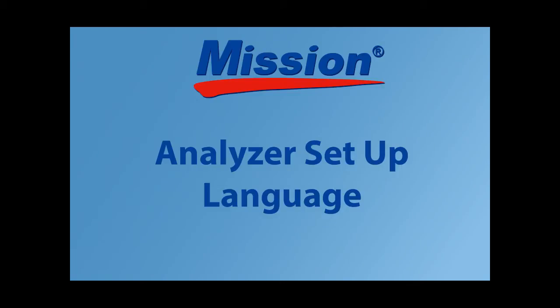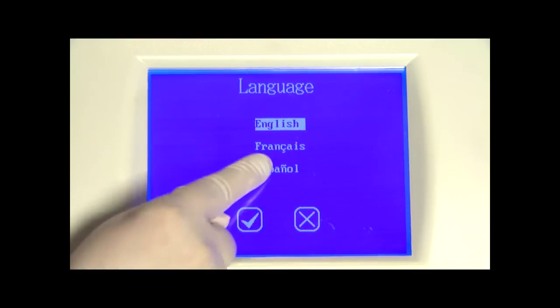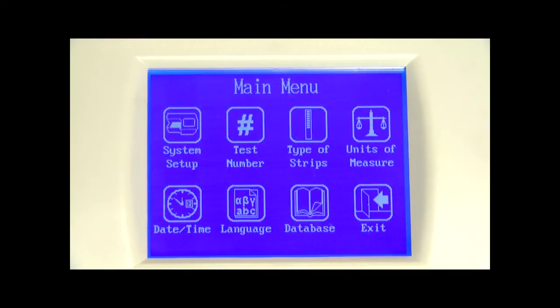Press the language icon from the main menu to view the installed languages — the current setting will be highlighted. Press the text areas to select the proper language. When the desired language is highlighted, press check mark to accept the changes and return to the main menu, or press cross mark to return without any changes.